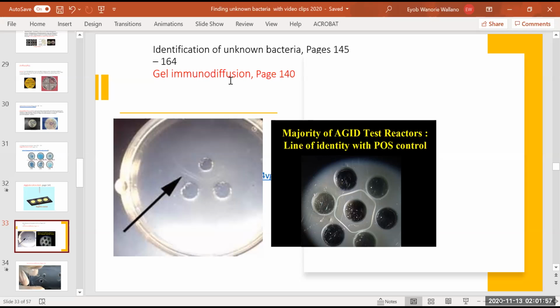It is going to be like this, but we are using electric current in a buffer solution. All that we are going to touch on in the future, how immunodiffusion is going to work also in the lecture part in serology. It's a very interesting topic. Western blot techniques, how they make precipitation lines, patterning between proteins, we are going to touch on in serology chapter 22. This is how we say gel immunodiffusion, precipitation.